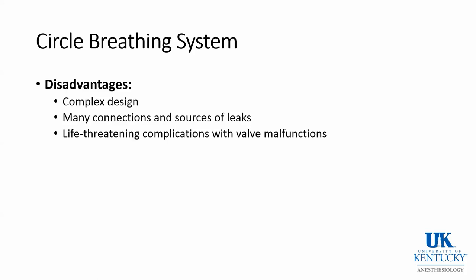In years gone by, valves would become stuck in the open or closed position, and the system would fail. It's for that reason that the valves are designed to be visible, so that the user can visualize the valve opening and closing.